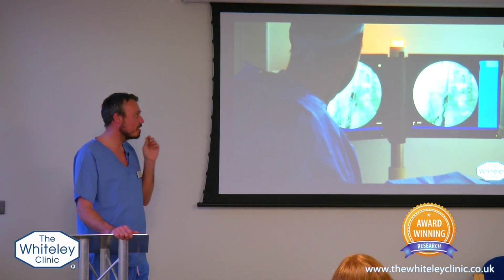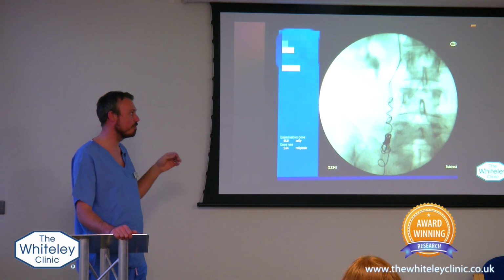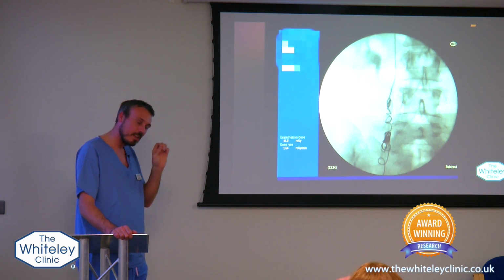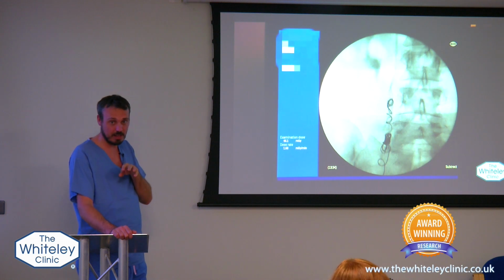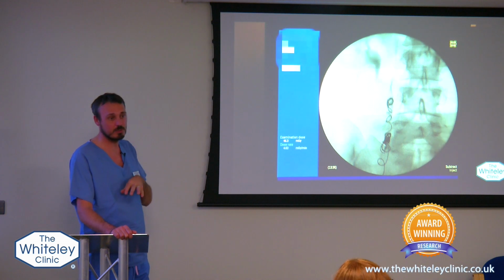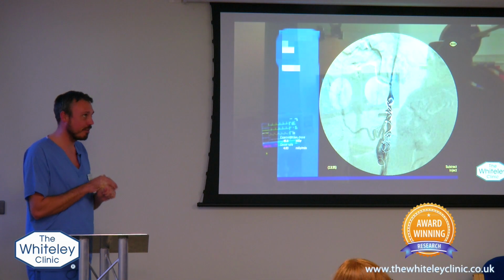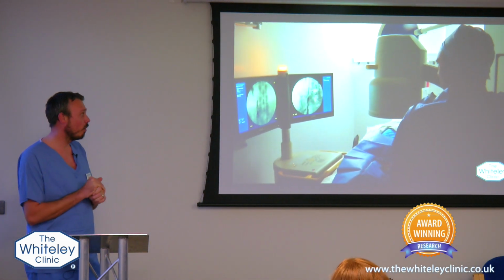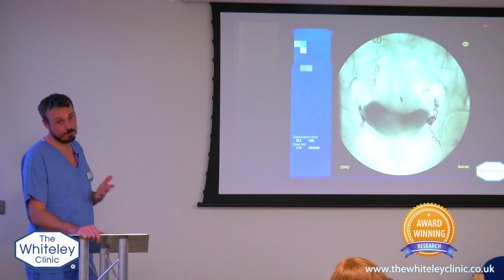Right. Okay. What you're not seeing on the coil here is, you're just seeing a long piece of metal, but the coils are made of platinum and they've got Dacron fibres on. And the Dacron fibres cause more of the irritation as well as the actual metal coil itself. The reason the coil is made out of platinum is because, one, it's completely inert. So I've never seen a patient have any form of allergic reaction to the coil, or any coil anywhere in the body. And that's obviously very important.